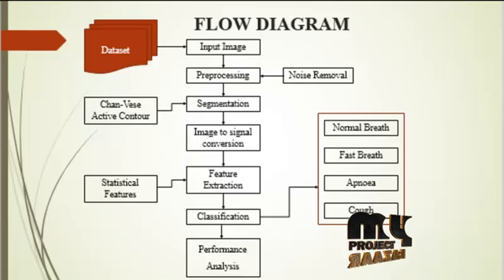Next one is the classification method. We are using SVM classification to find the four types of disease. In machine learning, pattern recognition and image processing, feature extraction starts from the initial set of measurement data and builds derived values, that is features, intended to be informative and non-redundant, facilitating the subsequent learning and generalization steps, and in some cases leading to better human interpretation. Feature extraction is related to dimensionality reduction.